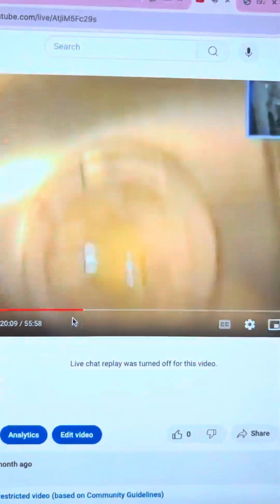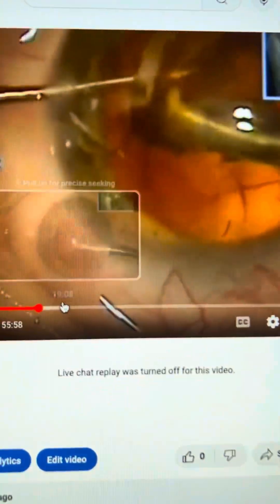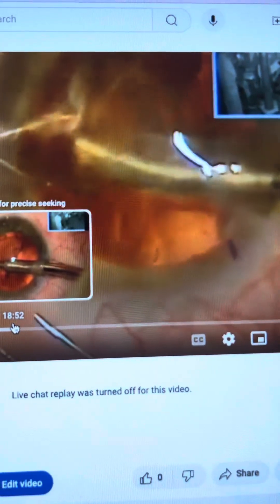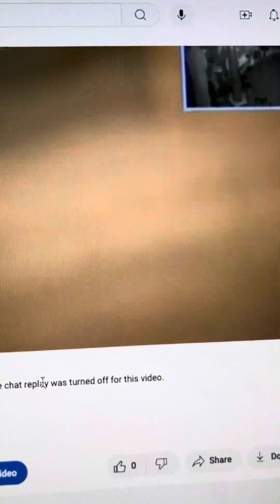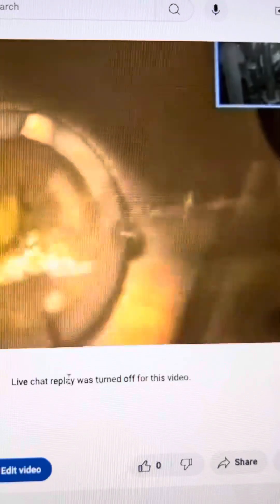We'll jump again to a further stage. We're removing the last dense segments of nucleus, very carefully, not damaging the posterior capsule. We'll reach the point to have a very nice procedure with no vitreous prolapse. We do have the ability to use a toric lens, and since we have keratometries beforehand — surface keratometry, not Pentacam, because as we know she has a DSAEK surgery — we're going to use a toric lens even in this case.